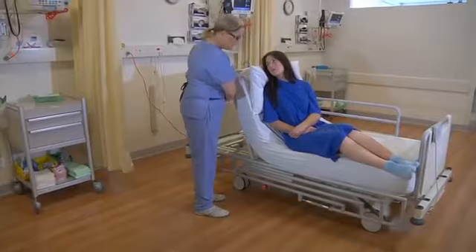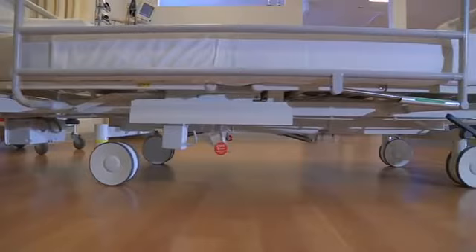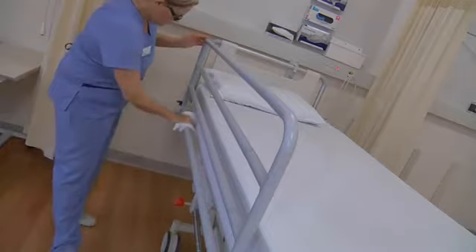With a focus on simply making human care easier, Howard Wright's research revealed four key areas for improvement. The first was a lower overall bed height for patient safety. The second was increased under-bed clearance for use of patient handling equipment. And the third and fourth to simply allow cleaners and maintenance staff to perform their duties efficiently without unnecessary bending.